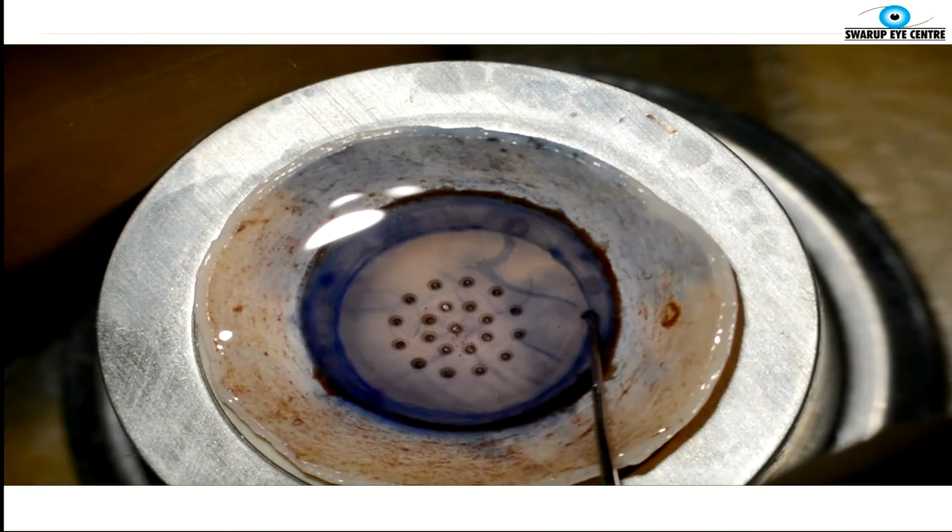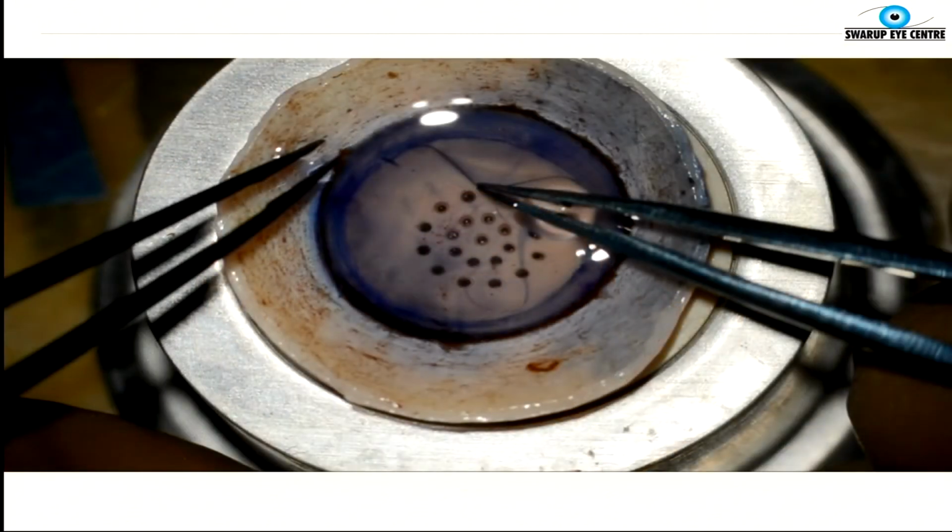It's a good idea to go all around and lift this Descemet's up, because when you punch, that Descemet's membrane gets tucked into that groove. So if you don't lift it all around, sometimes it can get stuck. Then you use a non-toothed forceps. In this case, I'm using a curved suture type, but you could use any blunt-tipped instrument, ideally one which has a broad tip, so it can grasp a larger amount of Descemet's membrane without traumatizing it. And you basically do this stripping under fluid so that the surface tension is reduced, something like the scuba technique.